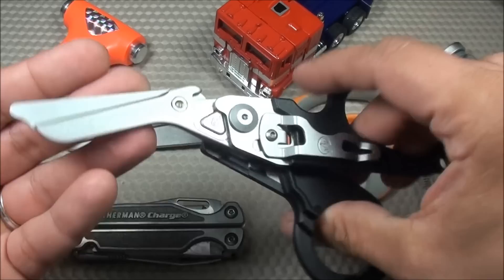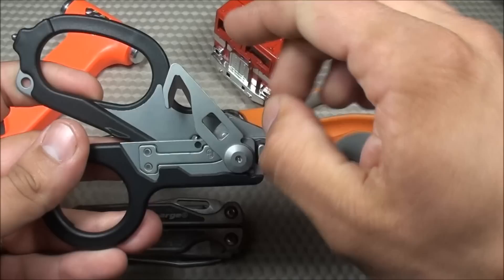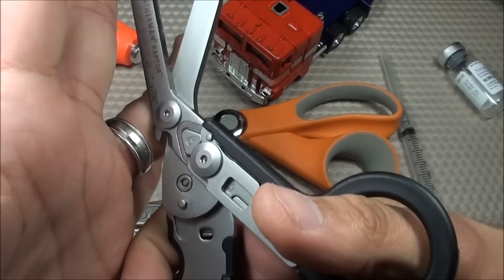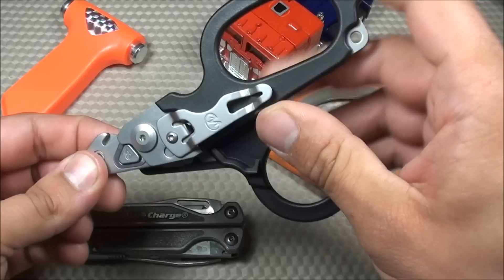Some of the features that it includes: it has 420HC stainless steel medical shears that cut through anything. It has a nice little seat belt cutter, a strap cutter, and an oxygen wrench. On the back, there's a little notch which is actually a ring cutter. It also comes with a lanyard hole, a glass punch, and a pocket clip.